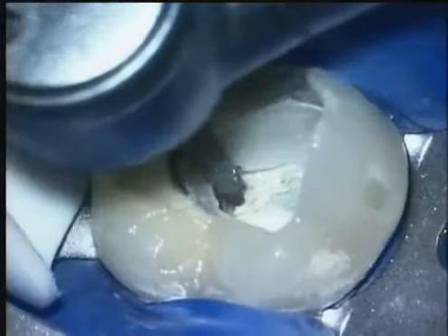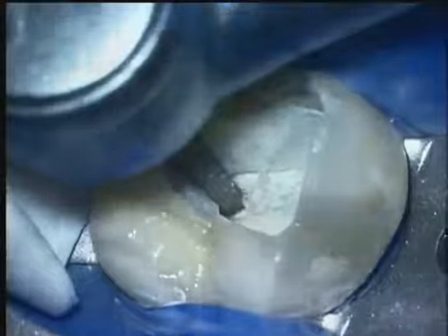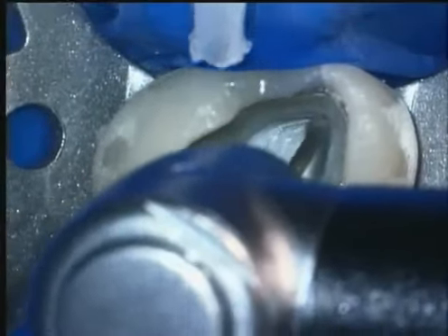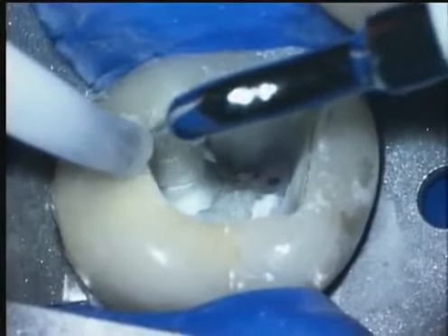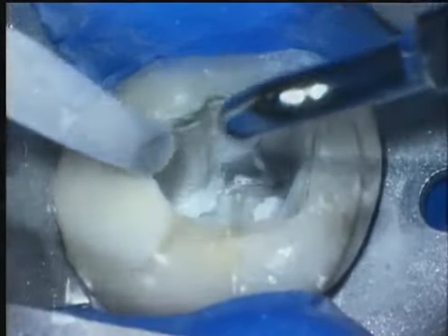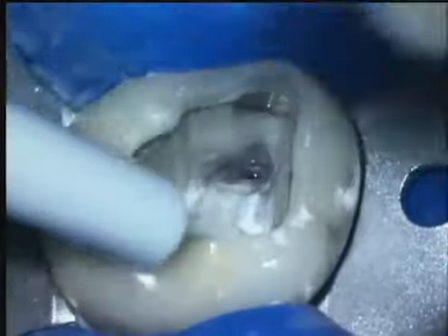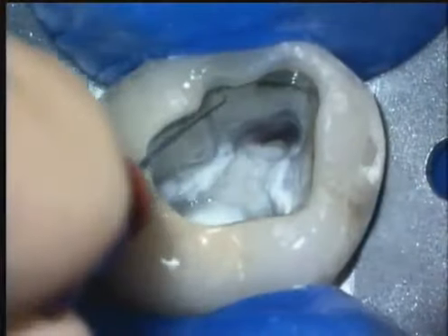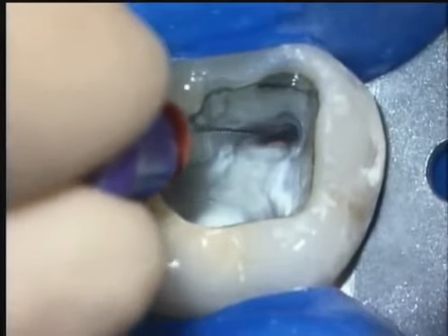Surgical length diamonds true up the axial walls and make them nice and flat so light can refract off them. GGs are run at 750 RPMs to marry the axial walls to the orifices. Ultrasonics precisely sand away minute amounts of tooth structure and help us find the MB2. Irrigate to flush out the pulp chamber. Notice how the tin file slides effortlessly down the mesial axial wall and into the MB2.